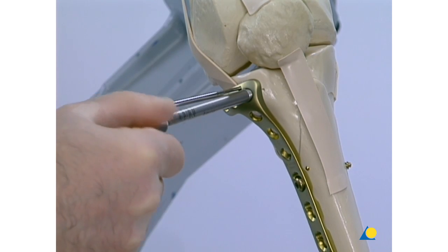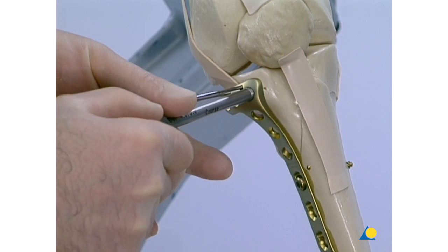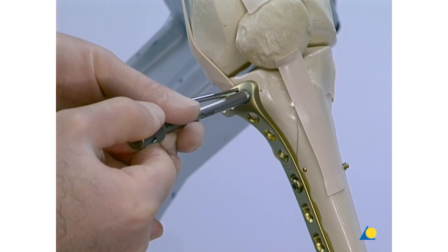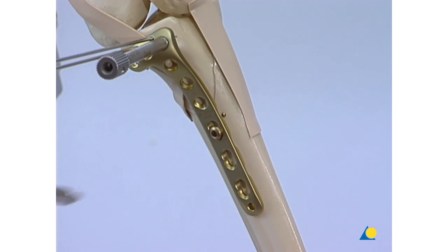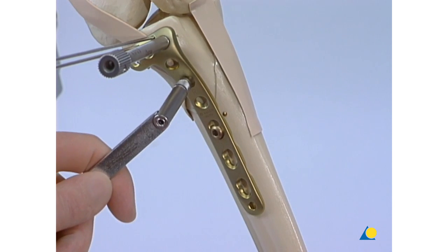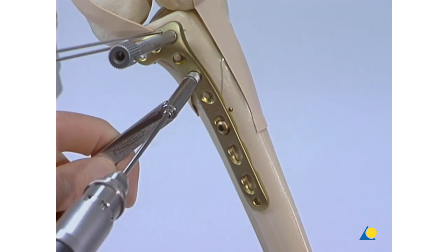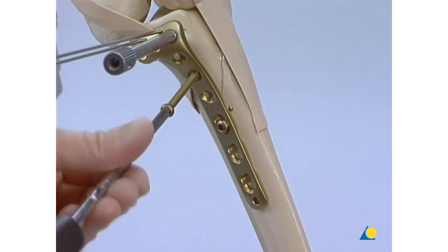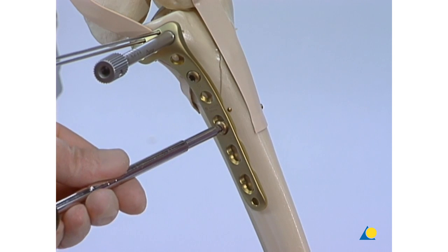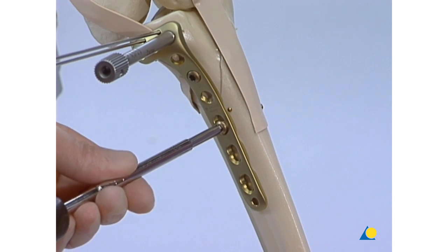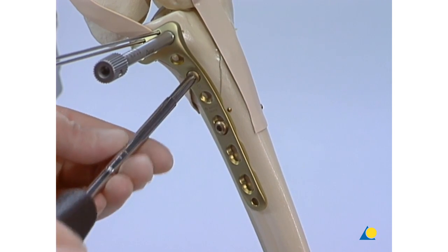The 5.0 threaded LCP drill sleeve is screwed into the most anterior of the proximal plate holes. This drill sleeve will show the direction of the most proximal locking head screw. The plate is secured to the bone proximally by using a 4.5 millimeter cortex screw. The two cortex screws are tightened sequentially to maximize the buttress effect.